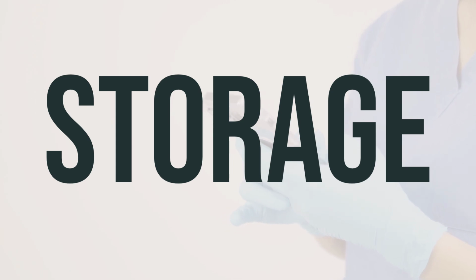Make sure to store your Epipen Auto-Injector in the carrying case or original packaging at room temperature, away from light and moisture. It's important to avoid extreme heat and cold, so don't store it in your vehicle or in the bathroom. And remember, don't refrigerate or freeze it. Check the expiration date from time to time and visually inspect the product for any particles or discoloration. If you see any, replace the unit before it expires. And as with all medications, keep it away from children and pets.